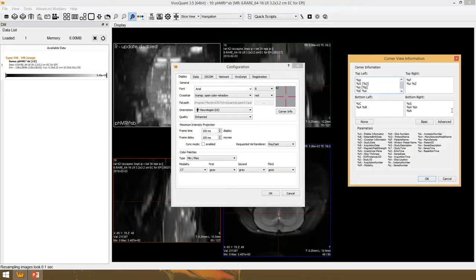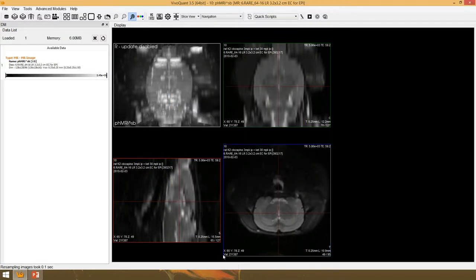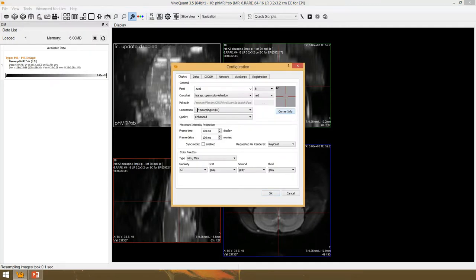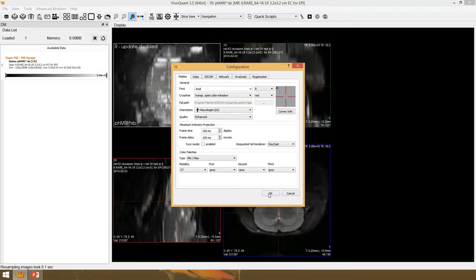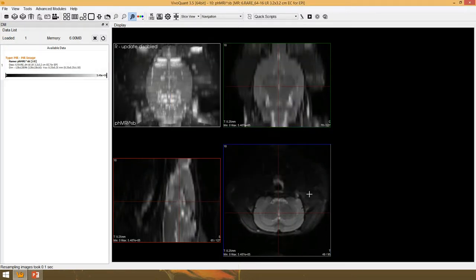To edit how this information looks or what information is presented, go to Tools > Configuration > Display tab > Corner Info. This brings up a user interface that lets you choose what parameters to display or not. For instance, if you're not interested in displaying the palette information or window preset name, you can remove those. We also have default settings — the Advanced is the full view, Basic trims the information down to a smaller subset. You can also turn this off completely under View.